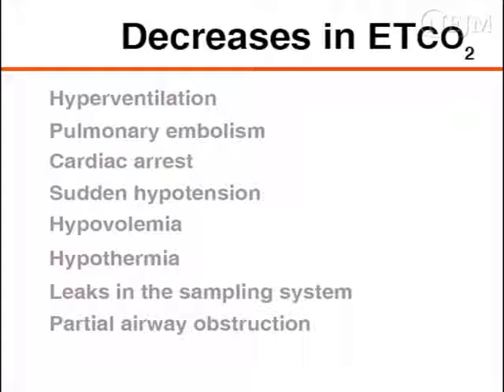Decreases in EtCO2 can be due to hyperventilation, pulmonary embolism, cardiac arrest, sudden hypotension, hypovolemia, hypothermia, leaks in the sampling system, or a partial airway obstruction.